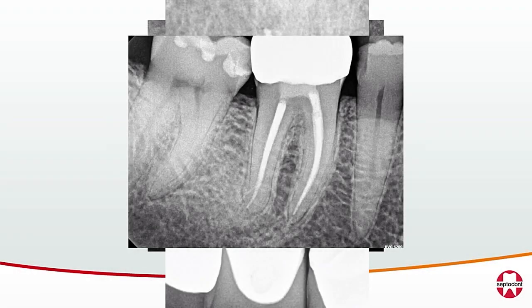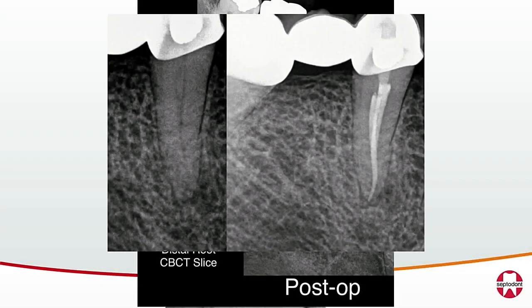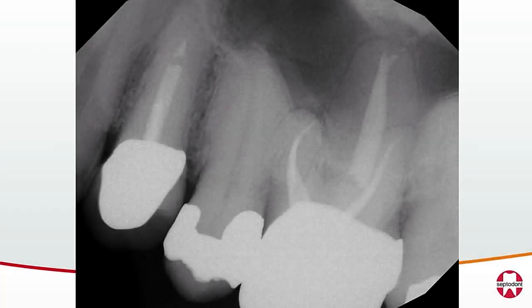So this one is kind of cool. You can see this little lateral anatomy here. I feel like the product does, as the name implies, flow well. So it goes into some of these places. You can see my small sealer puffs into potential space, necrotic canals, and apical lesions.